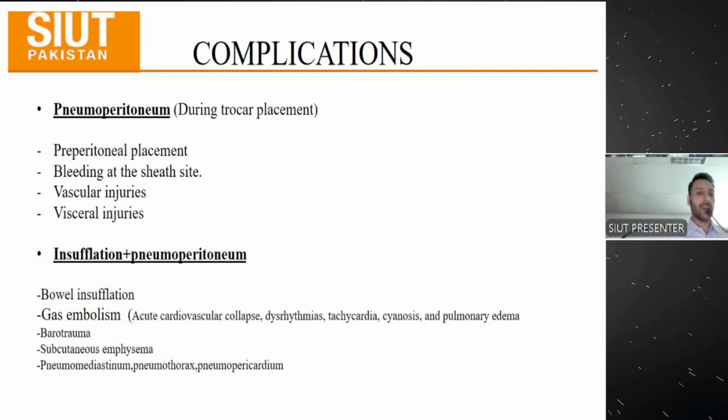The complications that occur during insufflation could be bowel insufflation. You have put in a Veress needle, and that Veress needle is inside the bowel, and you have attached the insufflation tube. Now the bowel is expanding. This is one of the complications.